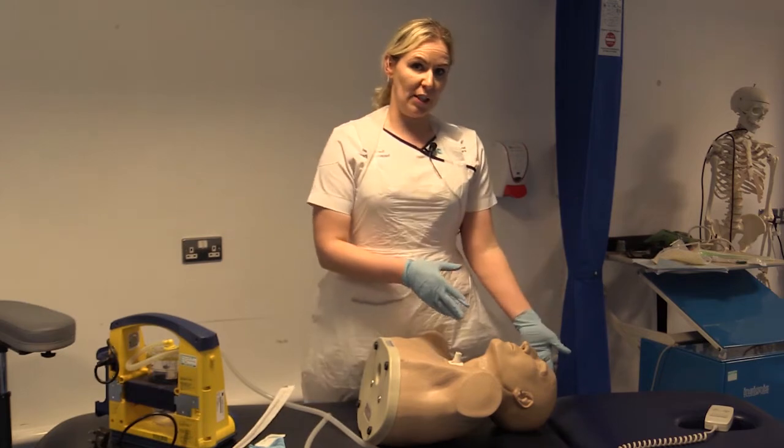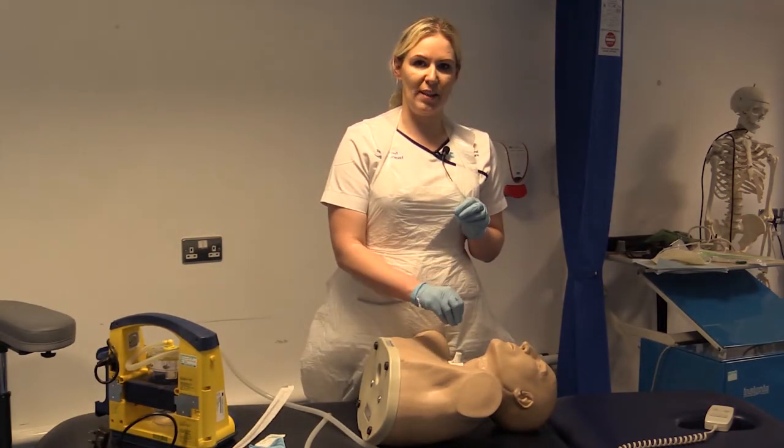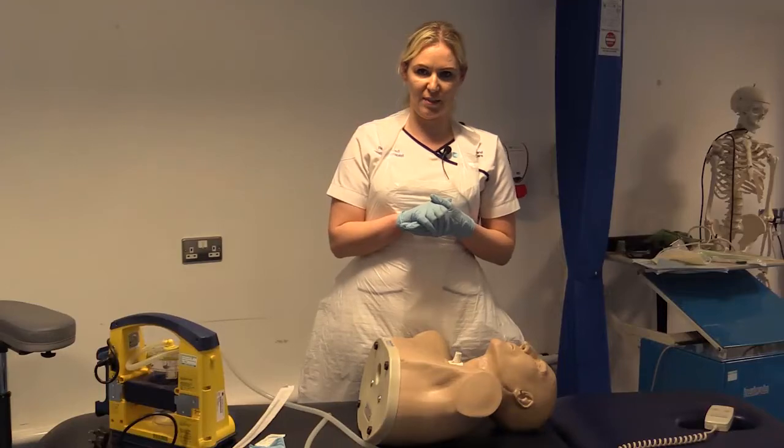Again, you're going to explain to your patient what you intend to do. You're going to pre-oxygenate your patient for 2 to 3 minutes prior to your suction. You're going to check the patient's clinical obs prior to proceeding with your suction just to make sure they're satisfactory.